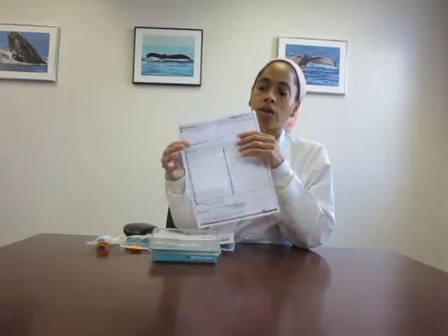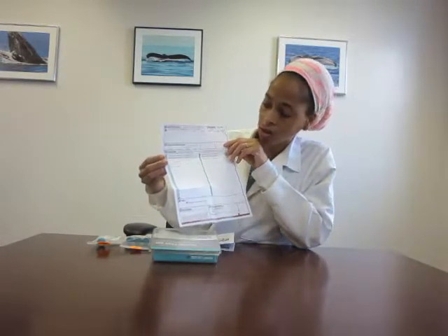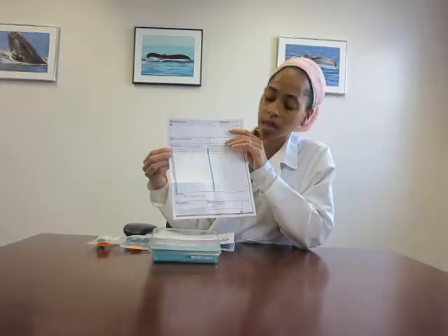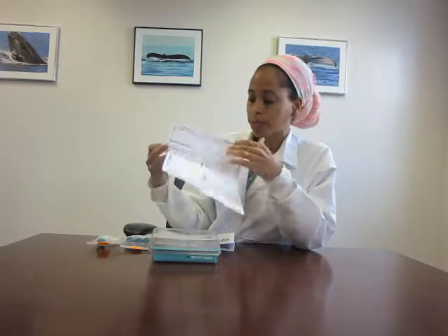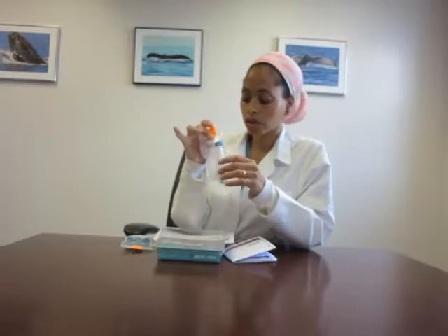Also, if you're on any medications, hormone medications, or supplements, that's on this next page as well. Really important is that we need to know the date and time for your collection, and you will do that by listing the day and the time on the tube.